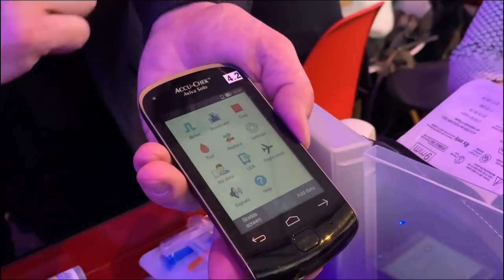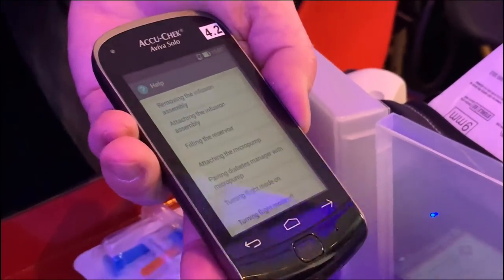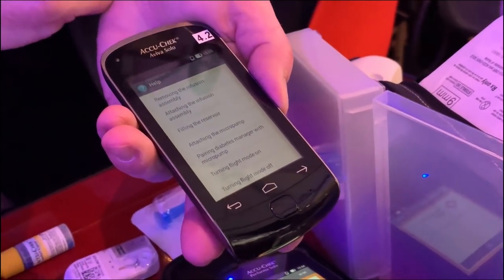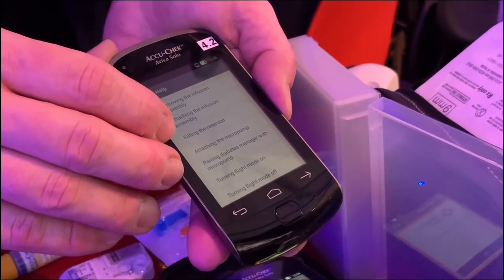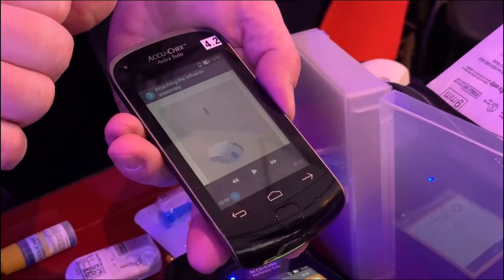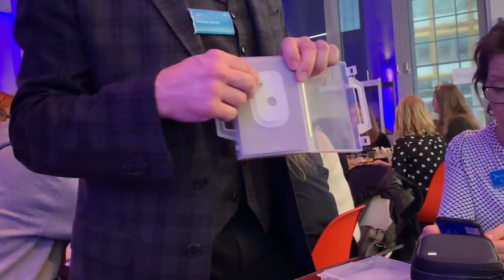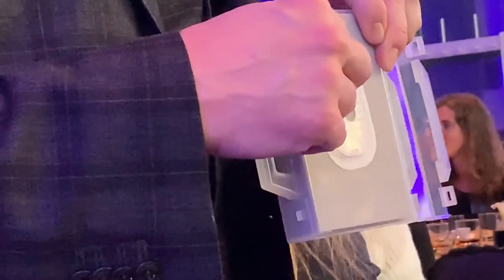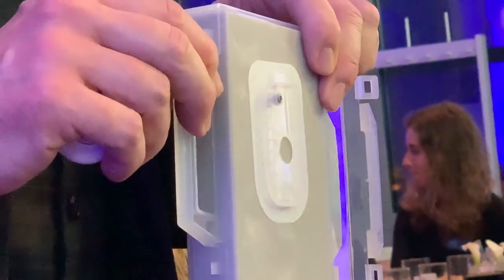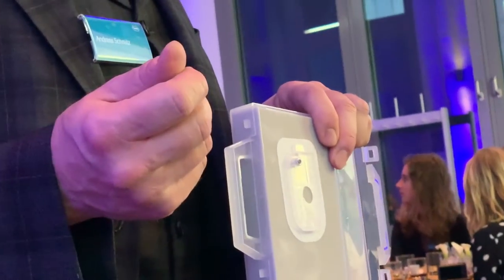There is a help section, and the help section is actually a collection of small videos, and one of them is attaching the infusion assembly. Gray piece here, that is where the cannula is. It's a Teflon cannula that goes into your skin at a 90 degree angle. Two cannula sizes, 6 and 9 millimeters, depending on what you need.